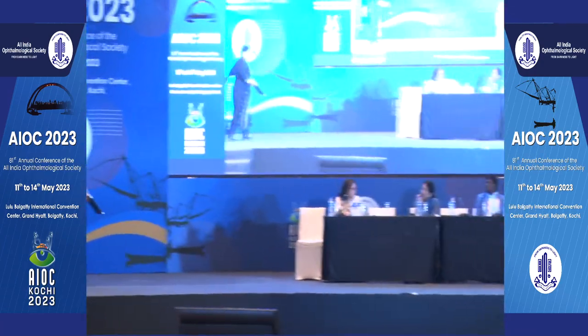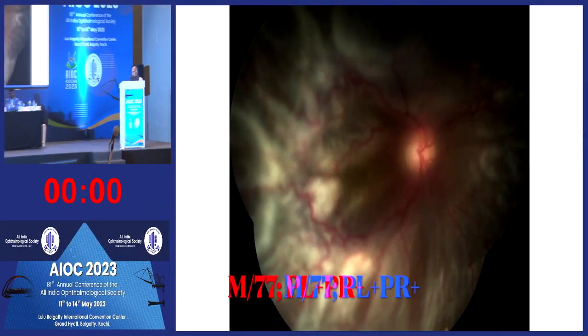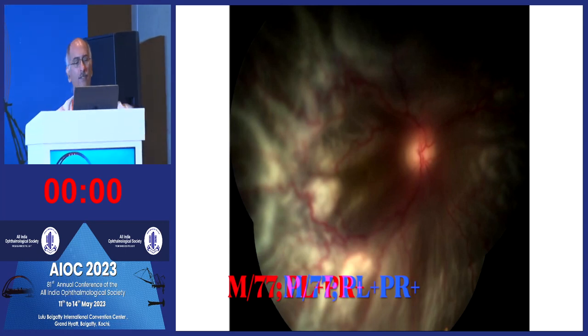So that would be classified as a stage 5C ROP, ma'am, with the corneal changes and all? Pardon? In the current classification of ROP, that would be stage 5C. Yes, 5C. So even 5C you've operated. Yeah. That's amazing. Never give up. Yeah, superb. That was wonderful, ma'am. So the curved vertical scissors were designed by yours truly and made by Dorc almost 25 years ago.